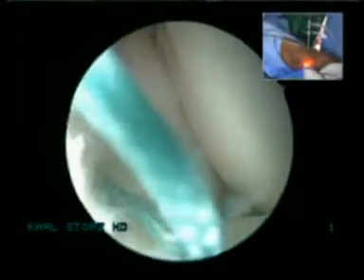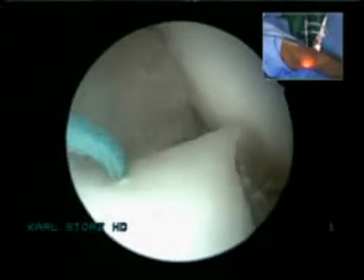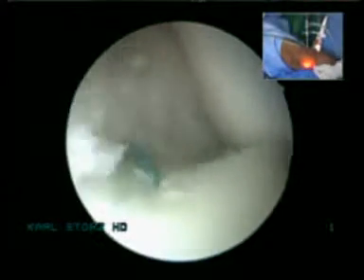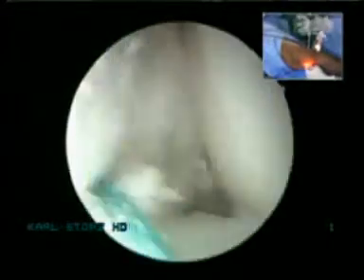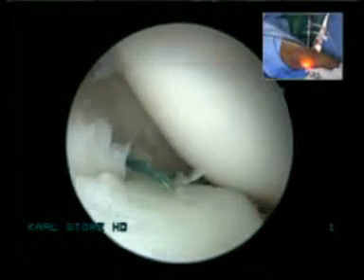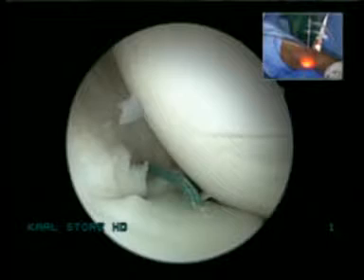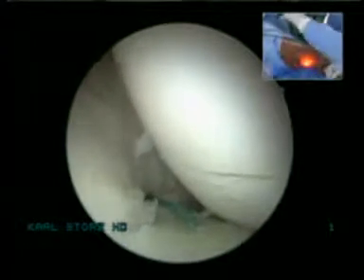There was a beautiful meniscal repair kit devised, and we used to use it in Australia all the time, which was basically just a single loaded needle with a handheld couple of loops, and you could put in five, and the boss could put in 10 outside-in sutures in the space of about 5 minutes. Wow. But it was reusable, and therefore the companies hated it because they made no money out of it whatsoever, and you can't get hold of it anymore.